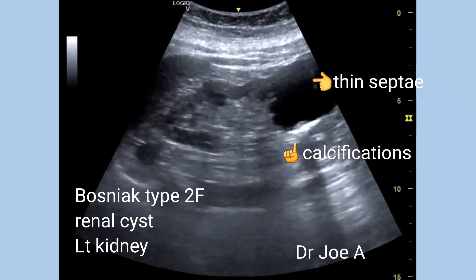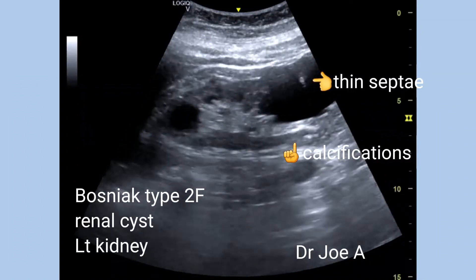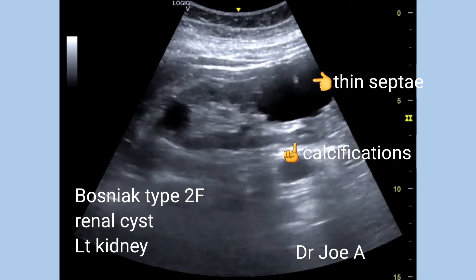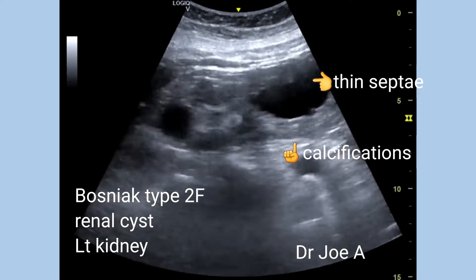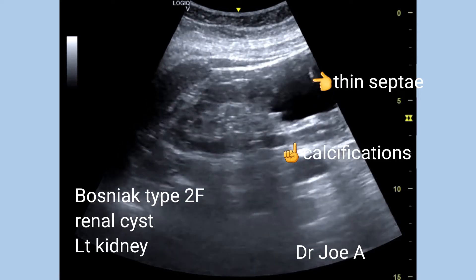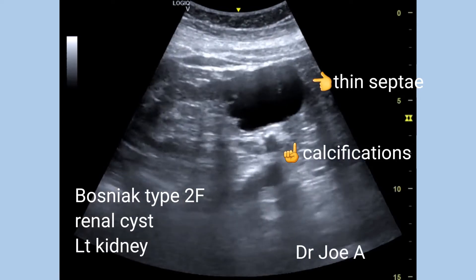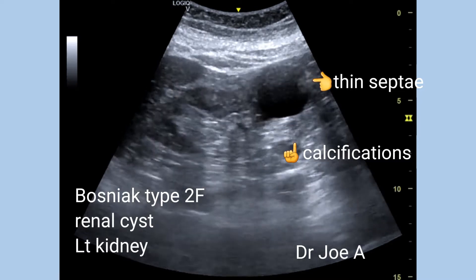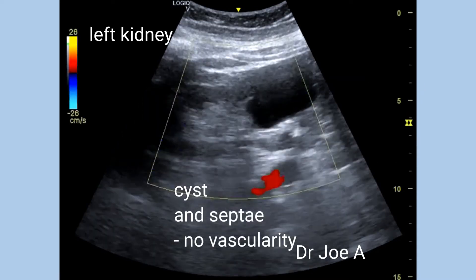This patient has bilateral renal cortical cysts. The left renal cortical cyst shows thin septae and wall calcification. Thus, this is a Bosniak type 2F renal cyst.